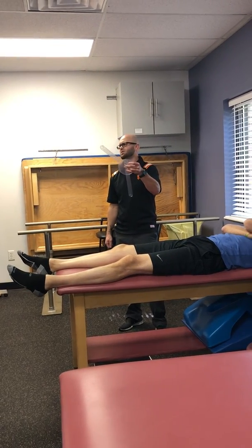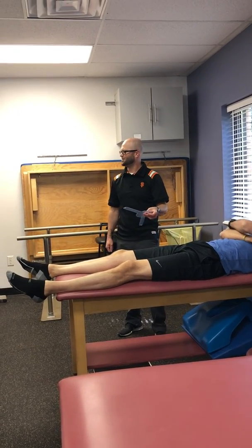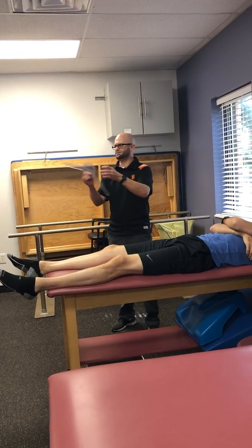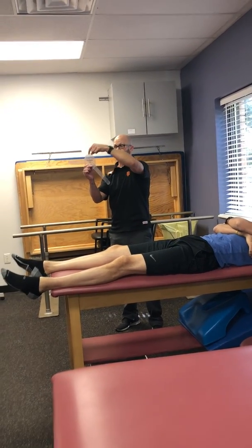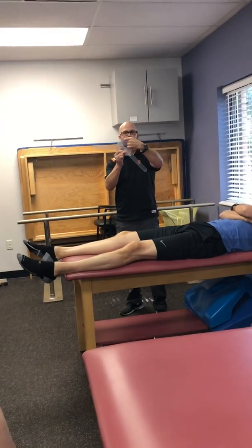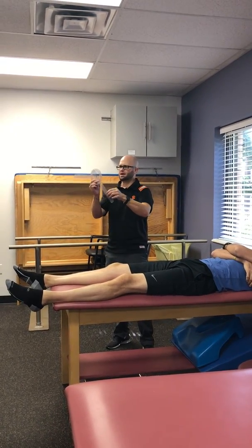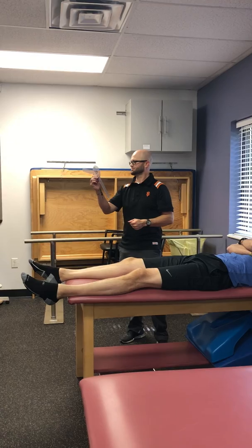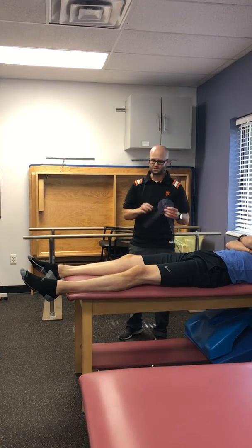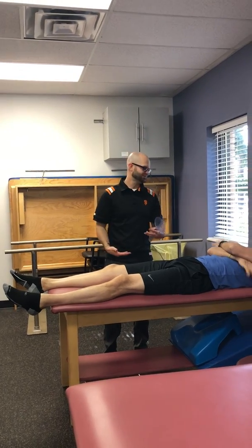oh no! I forgot where my 0 was. Oh no! Where was my 0 on there? Was it over here? Because there's a 0. No, it's up here, right? So remember, always find the 0. There's my number. I went that direction, and I just lost it. We'll say he got 45 degrees of hip ABduction. That is so ideal. It's like perfect. You're perfect.